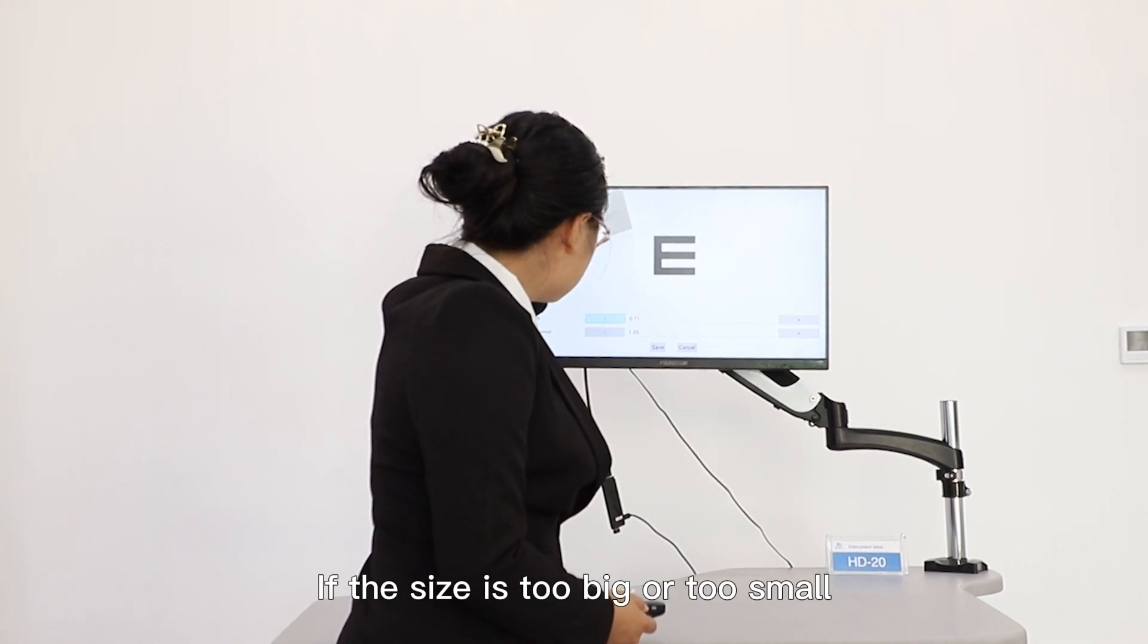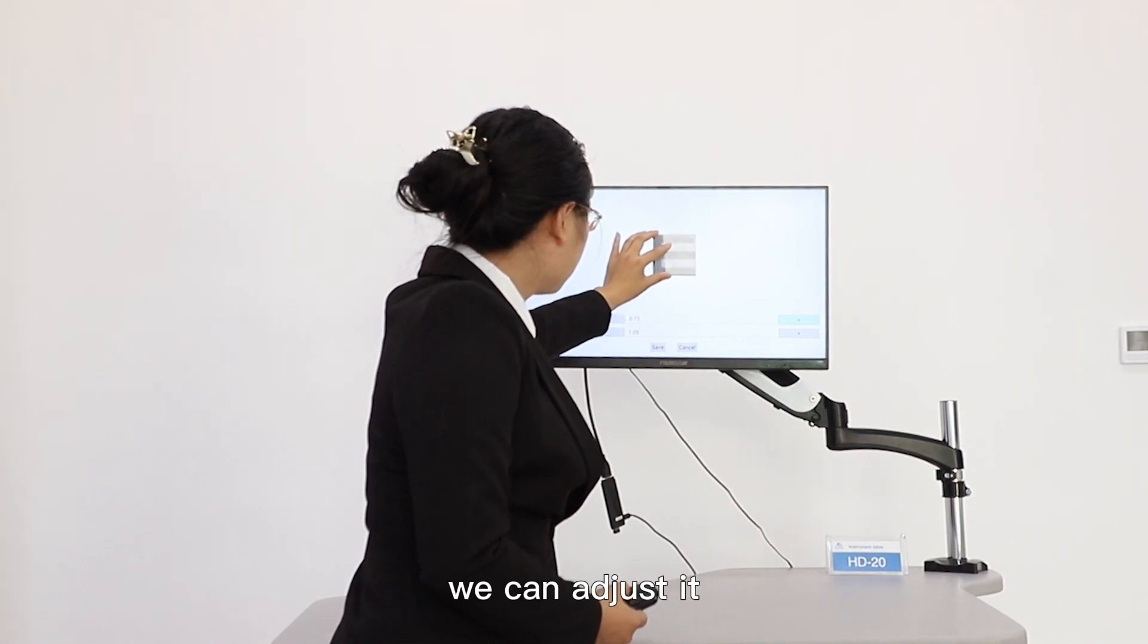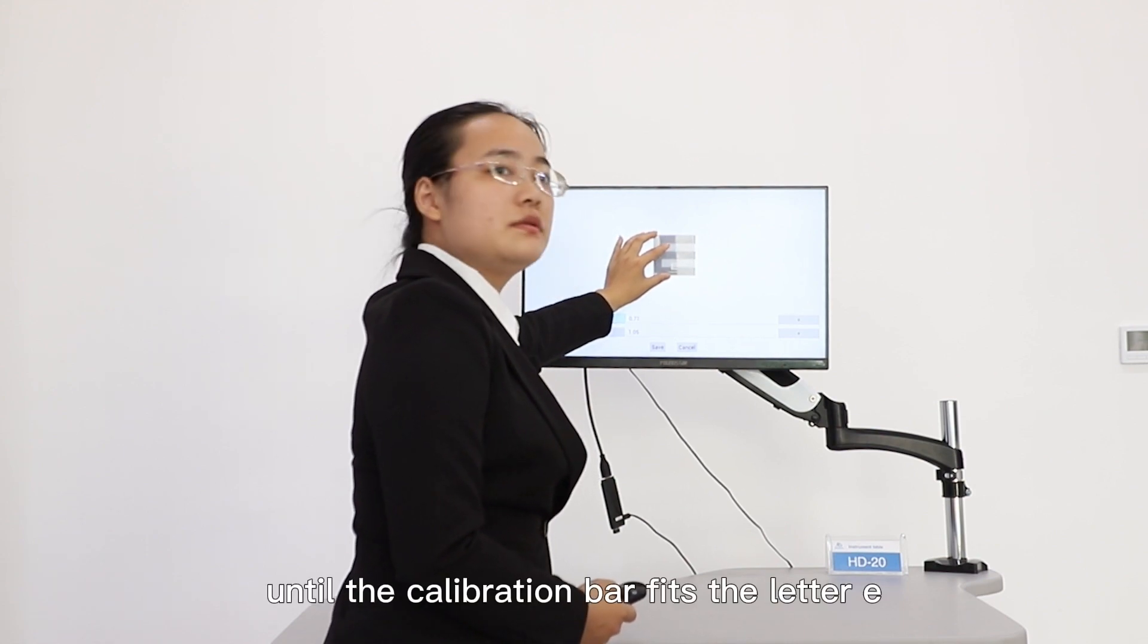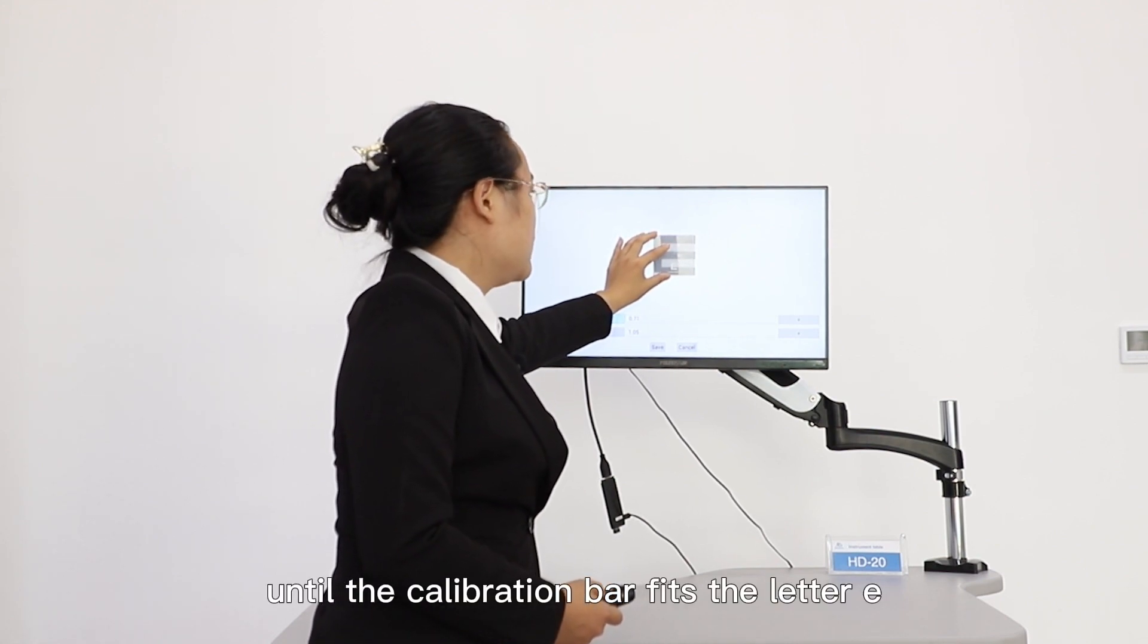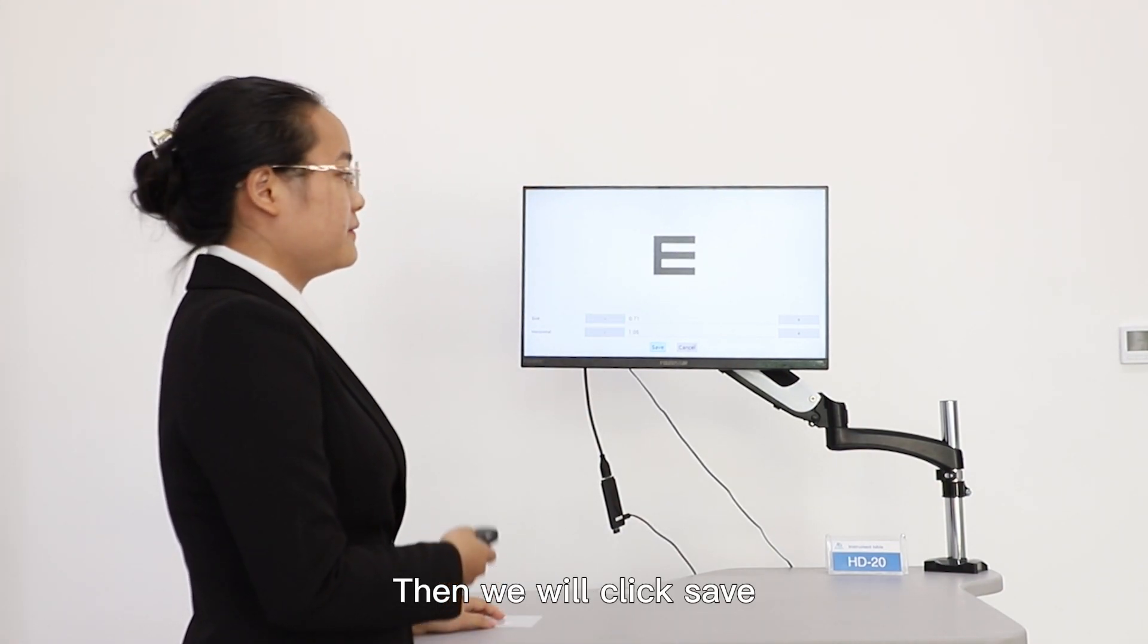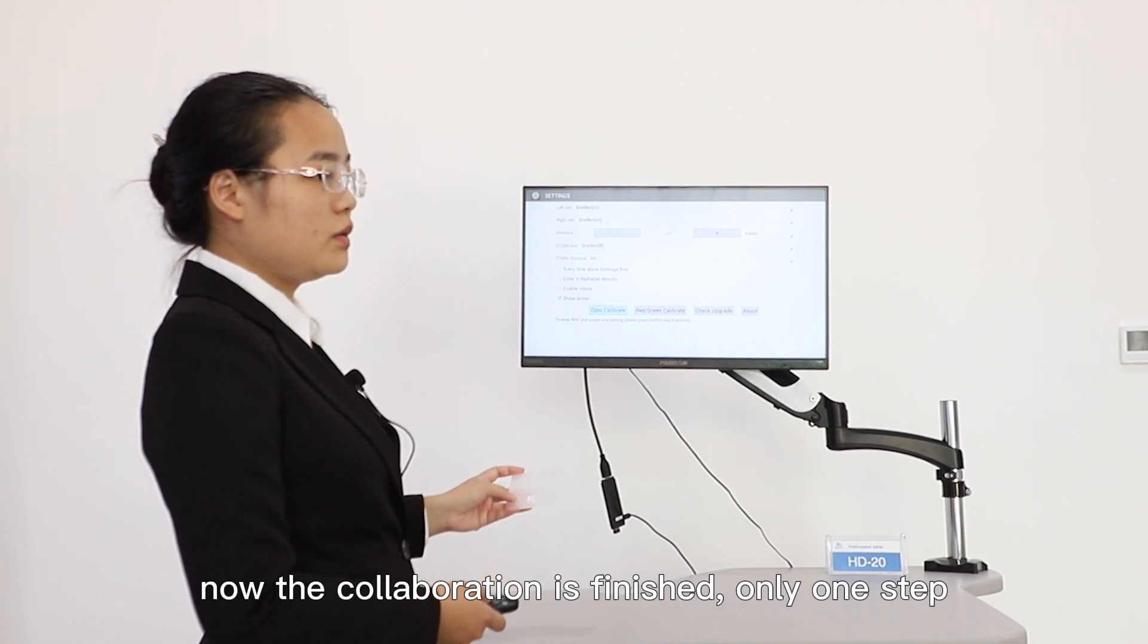If the size is too big or too small, we can adjust it until the calibration bar fits the letter E. Then we will click save. Now the calibration is finished. Only one step.